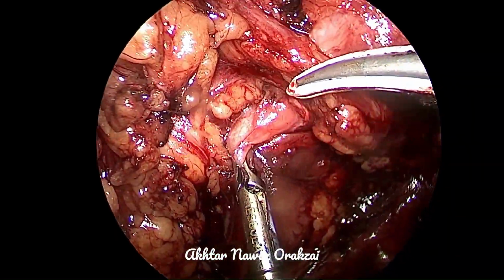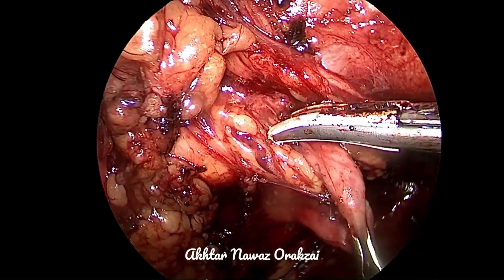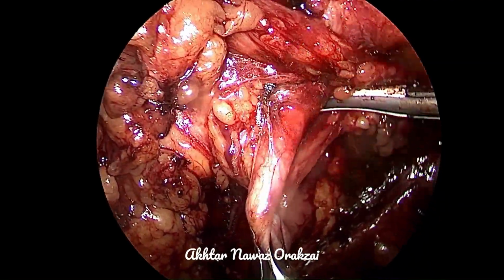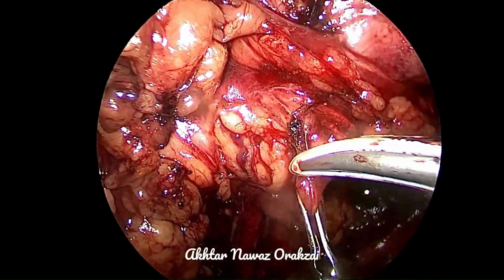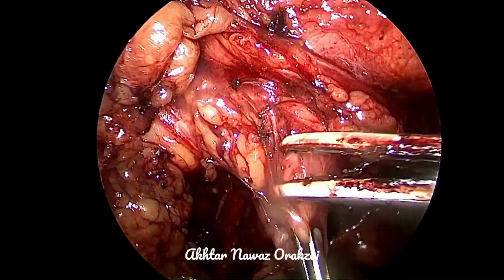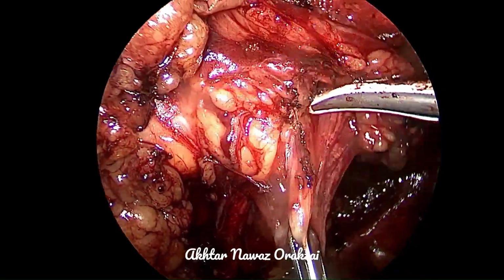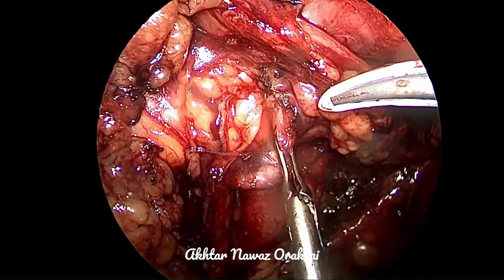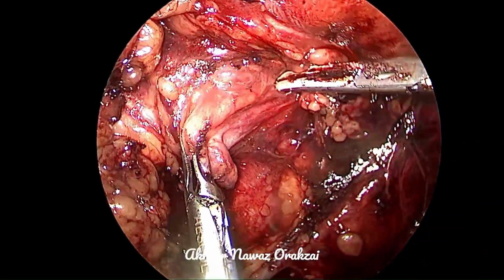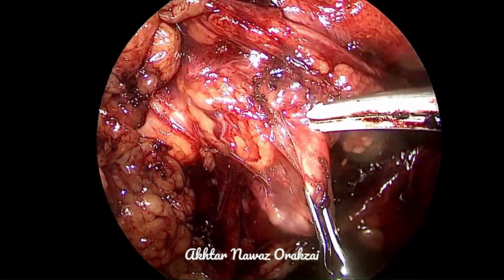However, a small injury to this vessel may lead to compromise of the renal parenchyma. In this case, maybe the whole posterior surface of the kidney, because these are the vessels which are providing blood supply to the posterior aspect of the kidney. Some people call them aberrant vessels.